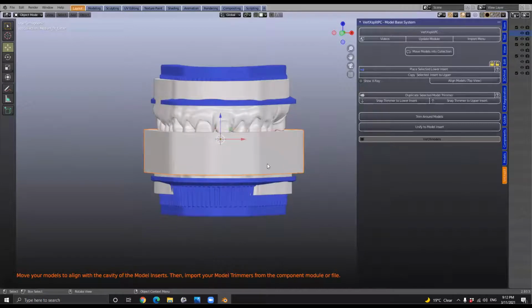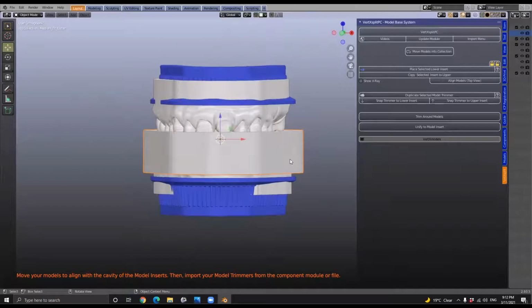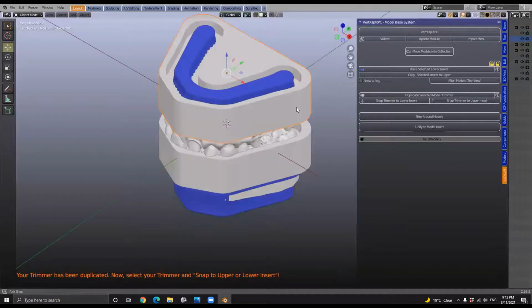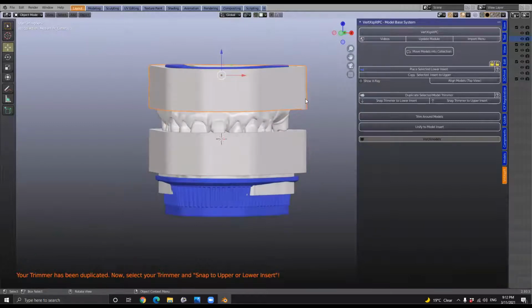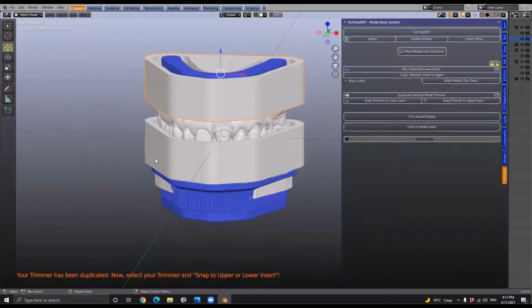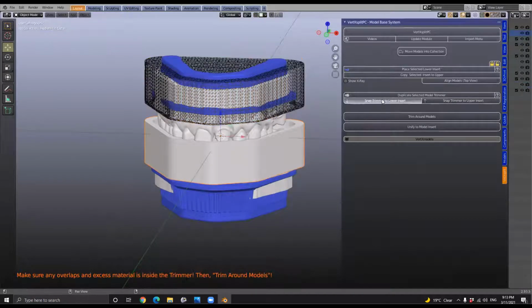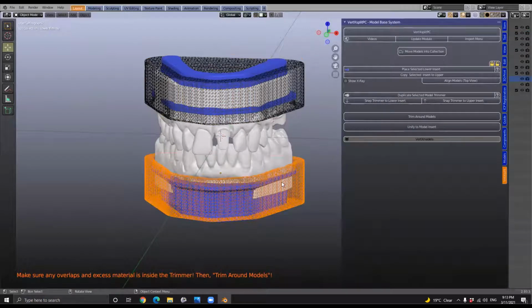Yeah, so now that we've got 2 models, we need 2 of these. And that's quite easy to do. We have this one selected, and we're going to duplicate this model trimmer. So this makes 2. From here, we're going to snap them. That's automatic, because as soon as I click, I'll choose one. You can choose one or the other. You can snap it to either the top or the bottom. It doesn't matter. So this one here, I'm going to snap the trimmer to the upper insert. And I'm going to select this one and snap it to the lower insert. Notice that it snaps it exactly where it should be.